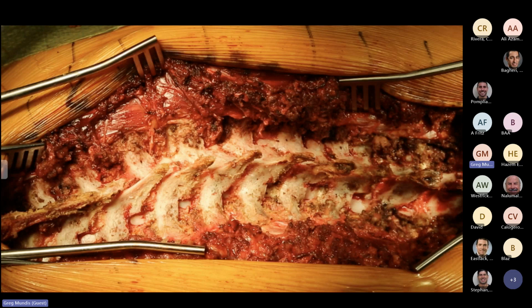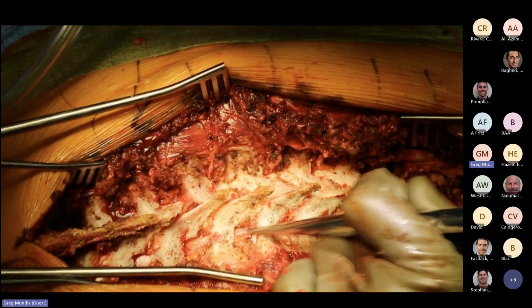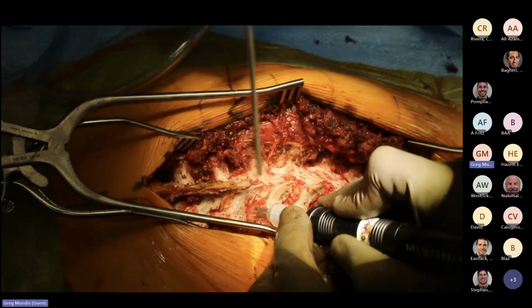So same thing here, you'll want to get a curette onto these, and that's what we're doing here, just taking a curette to all the different facet joints and taking the cartilage off, just to make sure that you have exposed bone, so that when you go to decorticate it later, you're getting a nice bony surface for fusion. So really important, I think, on the technical side of things there.